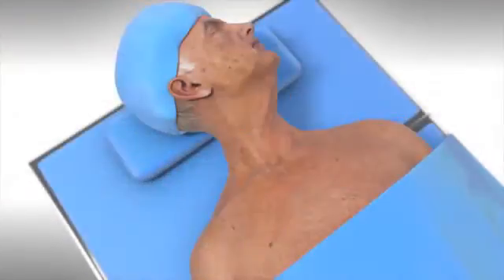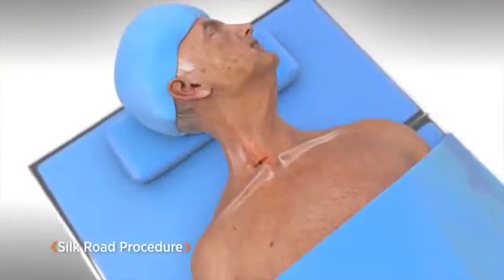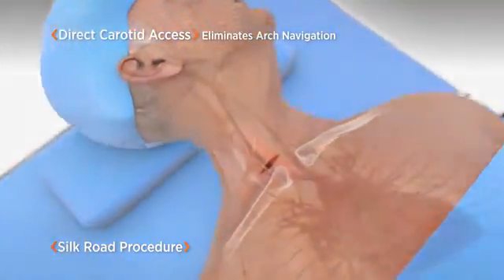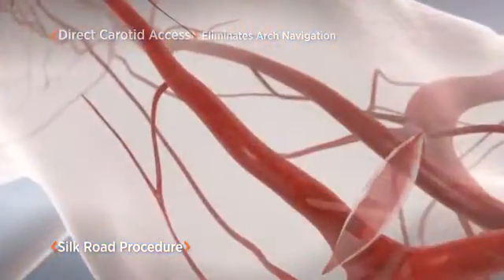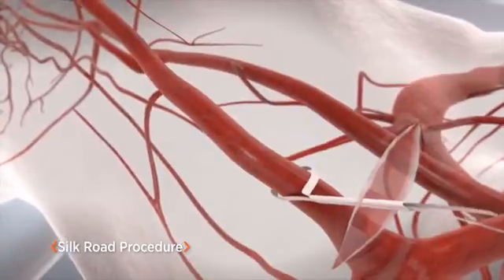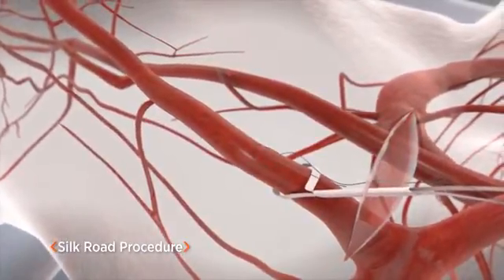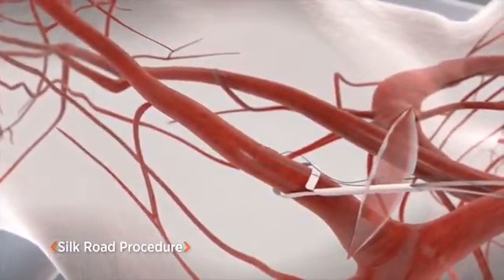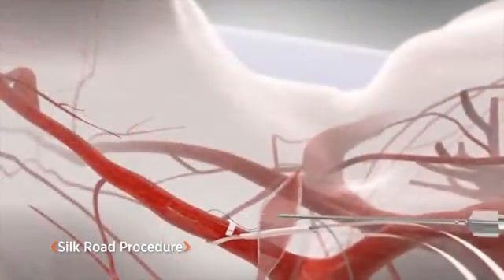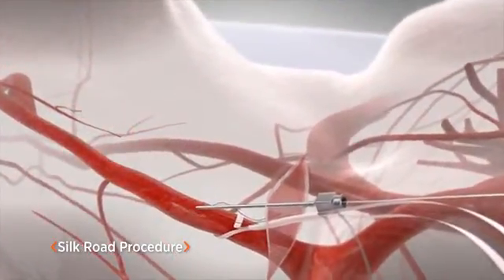The Silk Road procedure begins with a small incision at the neckline to expose the carotid artery. A loop is placed to control and clamp the artery during the procedure. A suture is also placed to close the puncture site at the end of the procedure.